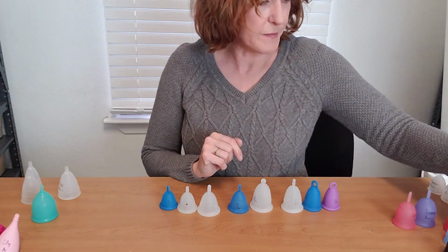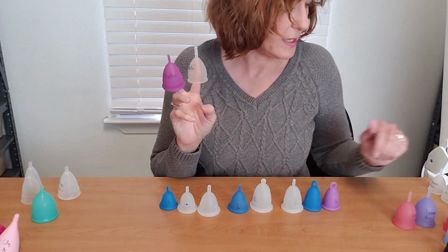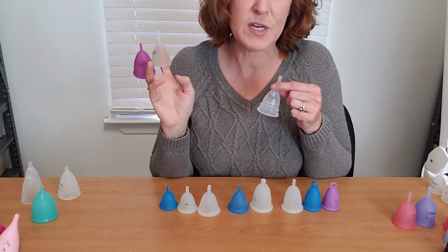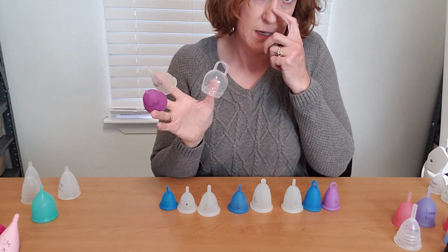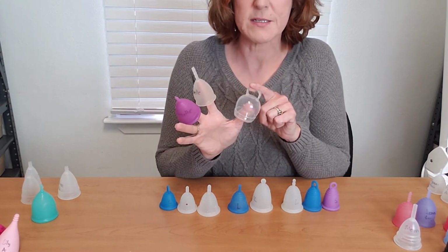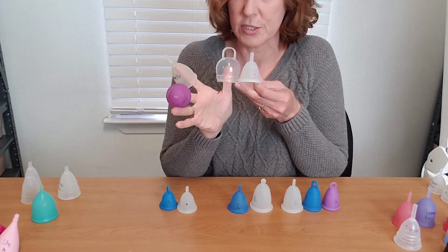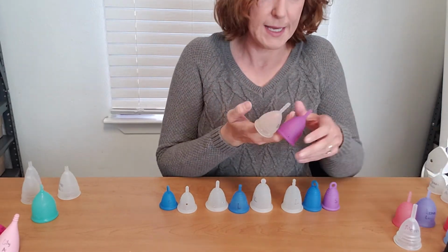Other cups we carry here at the office that we can compare to the Meluna size range are the Lunettes. We have a Moon Cup. It used to be fairly common. I haven't heard about somebody having a Moon Cup and it not working out in quite a while. So Femicycle is a totally different system, but certainly if you need something longer, shorter, or if this handle bothers you, but you want something for low cervix, we can definitely find something in the shorty size range for you that is just as short, but with less of a handle going on here.